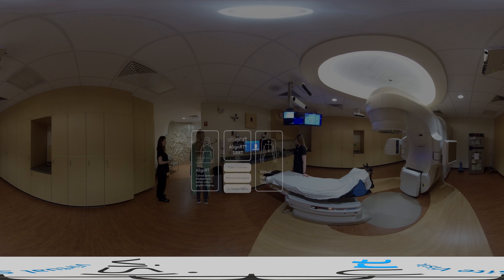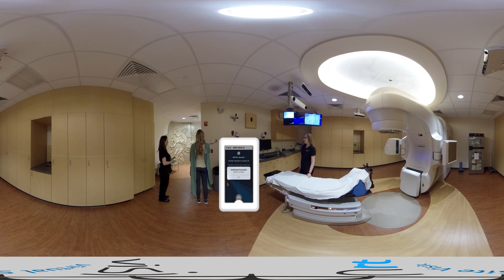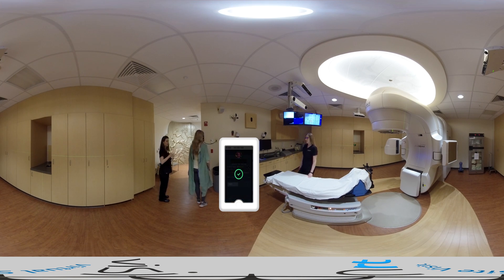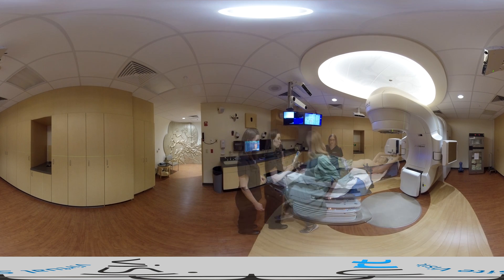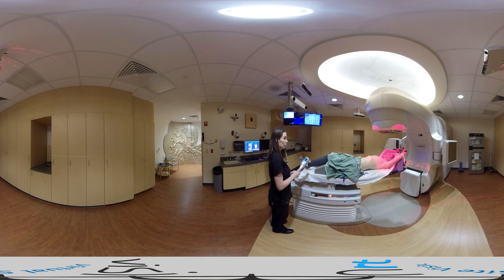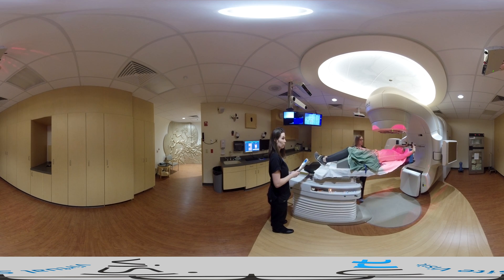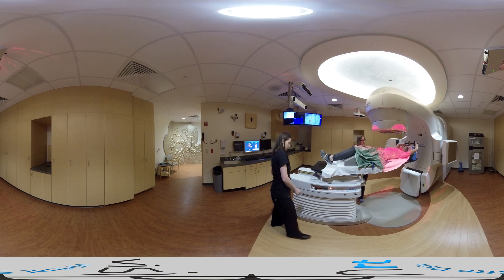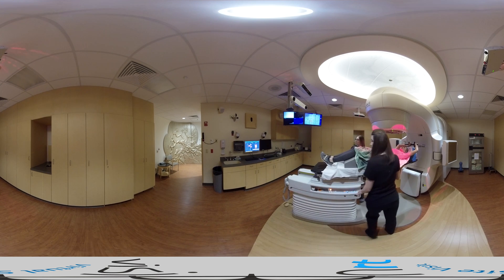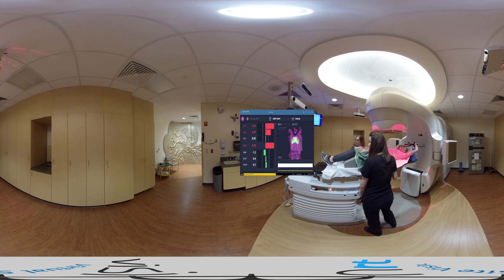For SBRT patients, our workflow is as follows. After the patient and their treatment accessories are verified with SafeRT ID, the patient is guided to lay on the treatment couch. We first move the patient to the general vicinity of isocenter, then begin monitoring with AlignRT. Instead of tattoos, we look for the real-time delta registration window in AlignRT.